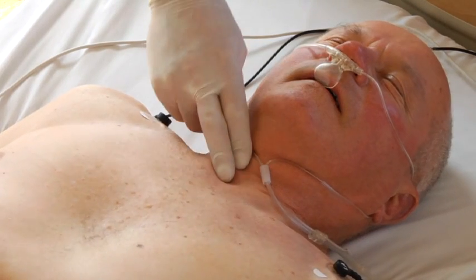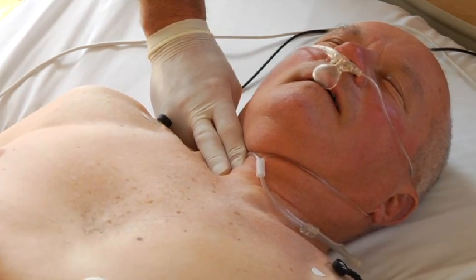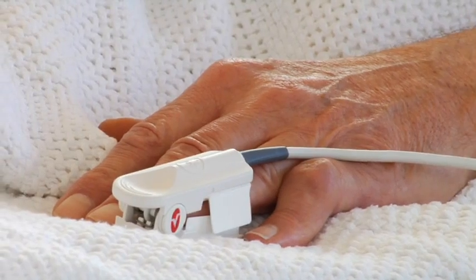The final step is to ensure that you also have mechanical capture. Palpate the patient's pulse and obtain a blood pressure. Pulse oximetry may also be useful.